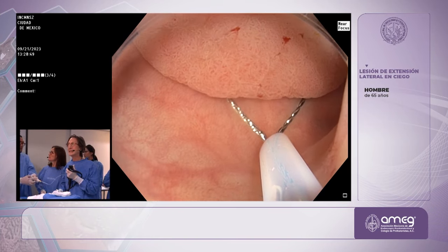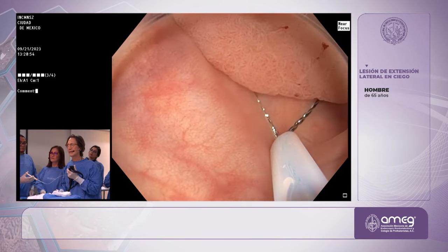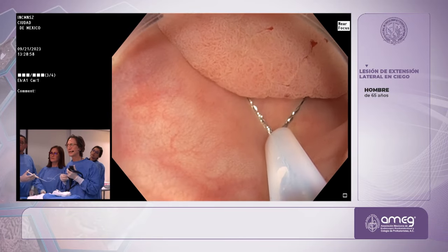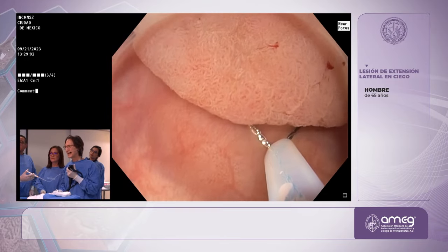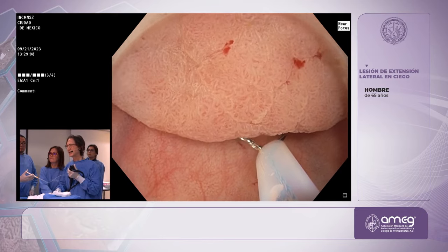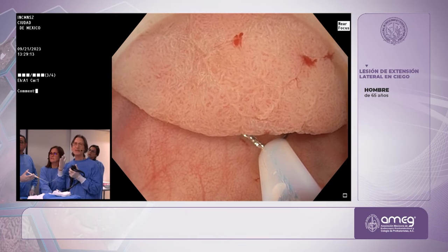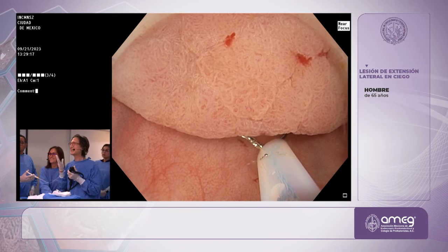And I might end up having to do some trimming. You can do a to and fro, rock back and forth like this, jiggle like this, different maneuvers. I call it torque and crimp, torque and then crimp. And then Angelica's going to hold the scope just pushed in a little bit. I'm still sucking. Suction is not that great, but I'm waiting. And you have to have a lot of patience underwater. If you don't have patience, you shouldn't do this because it takes a lot of patience.